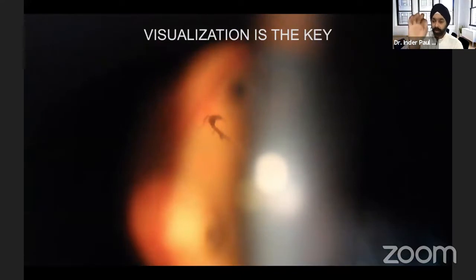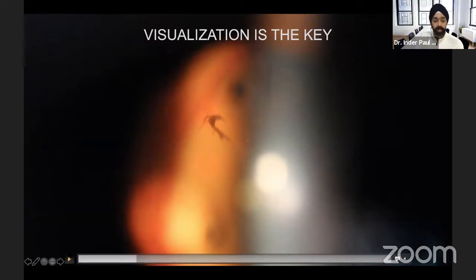Now what I'm going to do is I'm going to go back to the retina. So there's the floater. You see that there, I paused it. A beautiful view of the floater with a red glow behind. This is coaxial illumination. No other laser will allow you to get this kind of a view. Now I can see, okay, where's the floater? Let me go back to the retina.